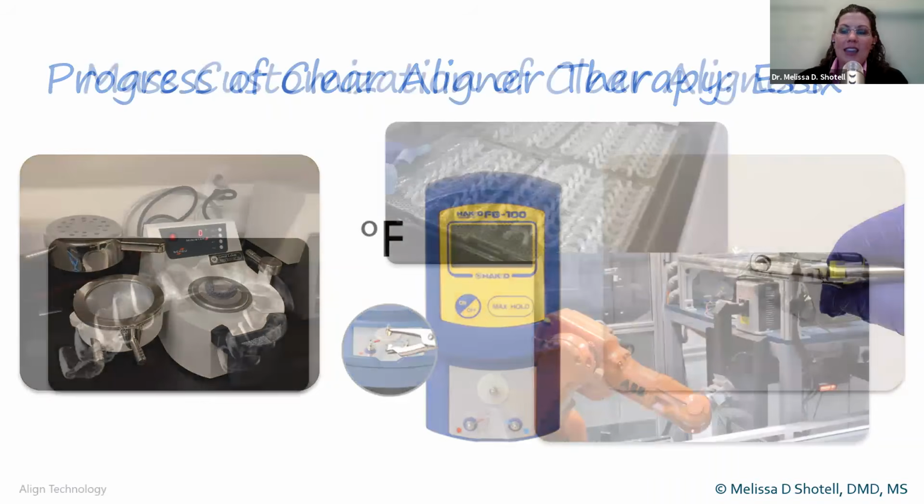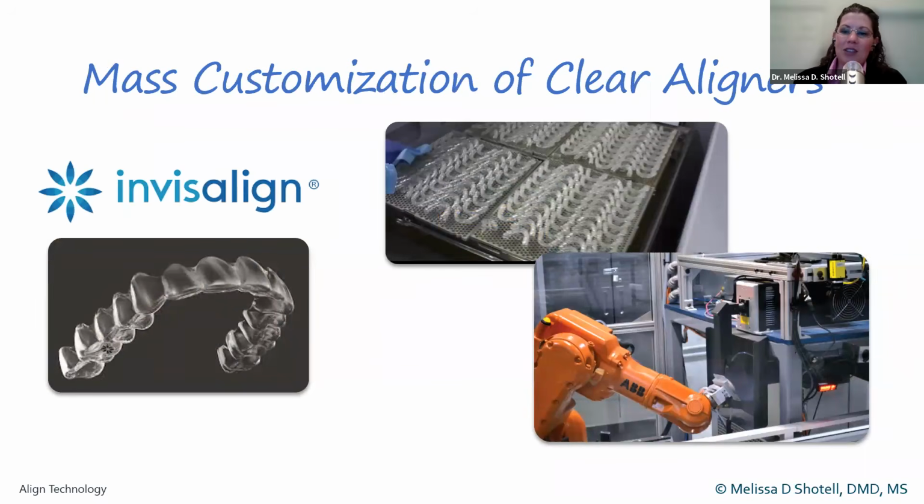We've seen the development of mass customization of clear aligners, and the first clear aligner laboratory was Invisalign from Align Technology, and this really mass automated the process.